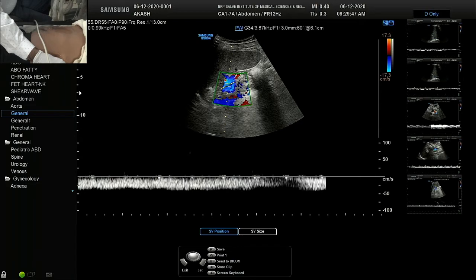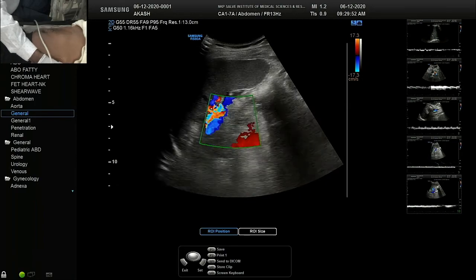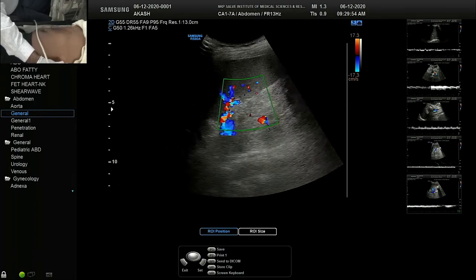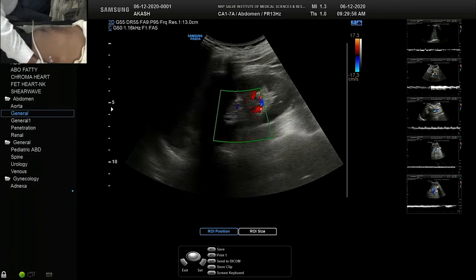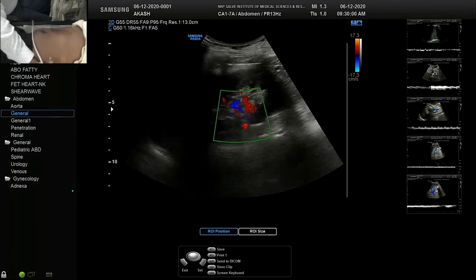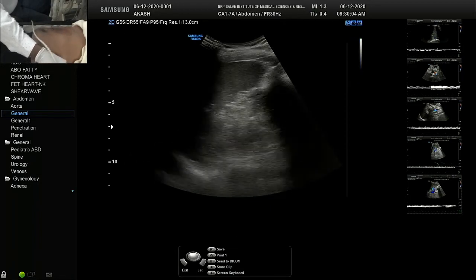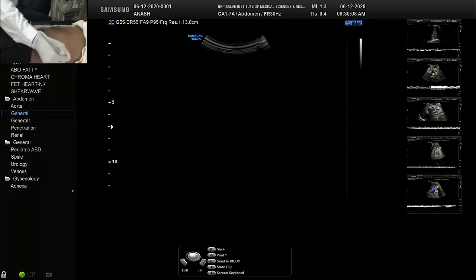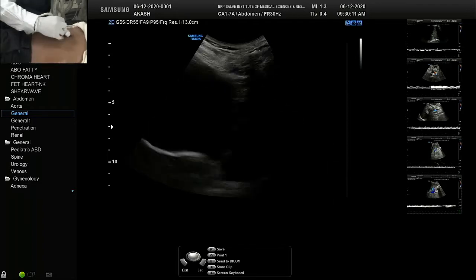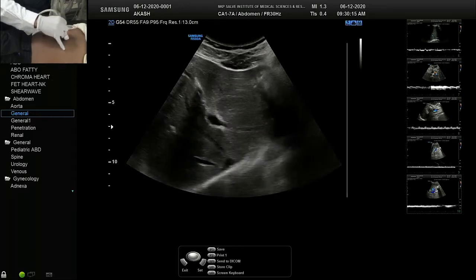So similar flow like a portal vein. It's called undulating flow, monophasic flow towards one side. That is the kidney. So we have finished almost all of the normal portal vein Doppler here, and now we will see the cases.